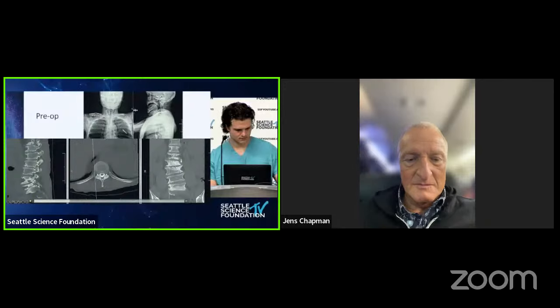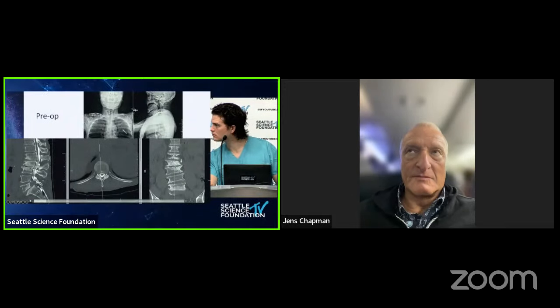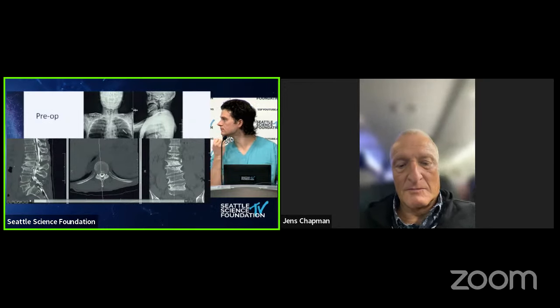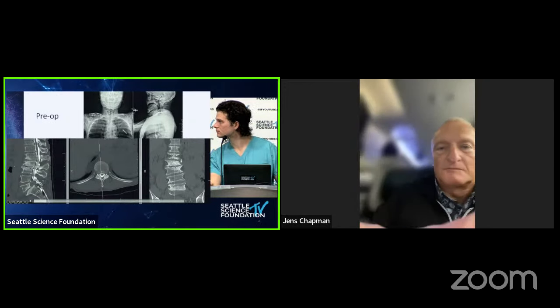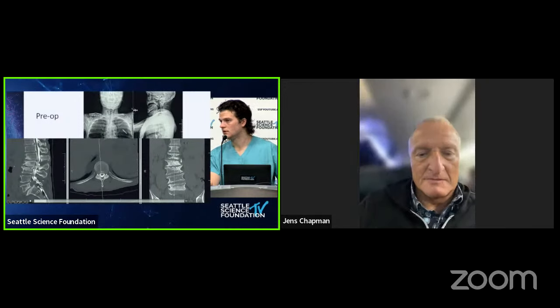And then if you do 2, now you've got that junctional, where he's got some coronal imbalance at L2-3. So these are difficult cases. Do you just end it at L2, or where do you end a case like this? Because it looks like he's got some coronal imbalance there, kind of in the apex.